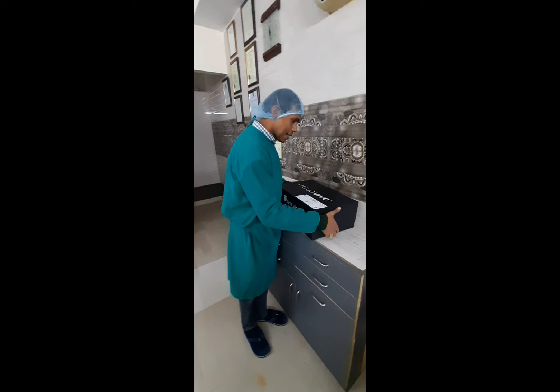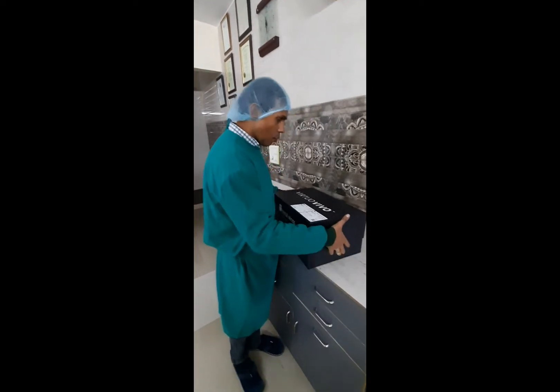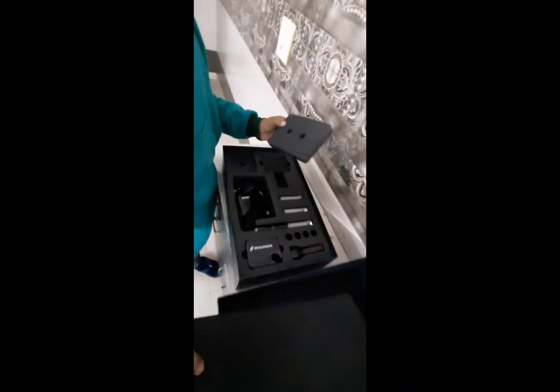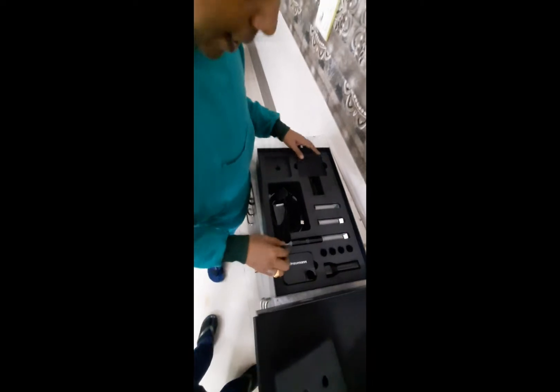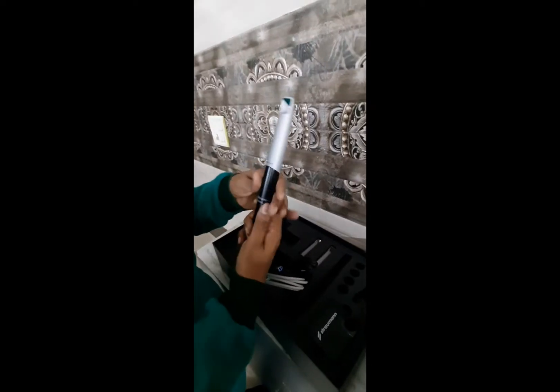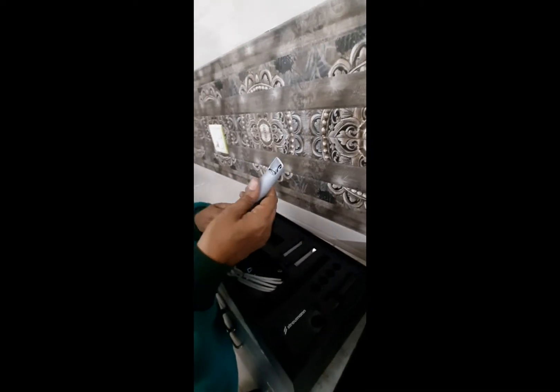Let's open it up and see what's inside. It's pretty exciting. So here we have the brand new scanner, which I was waiting for, and these are the sleeves.